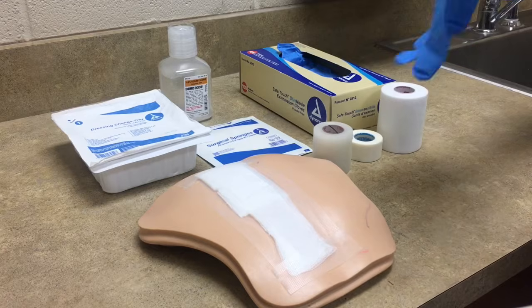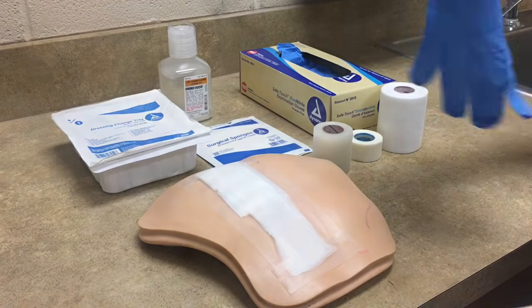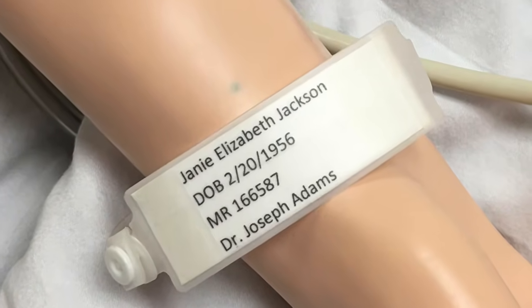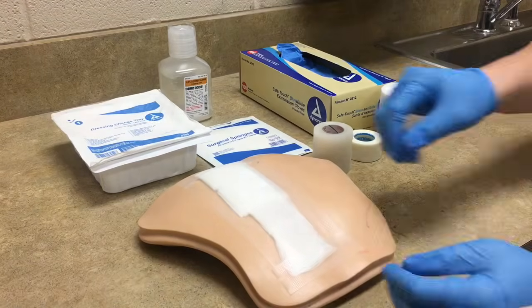We'll start our dressing by performing our hand hygiene and applying exam gloves, which will be non-sterile gloves. We would want to identify our patient using two patient identifiers, being the name and date of birth. We will carefully remove the soiled dressing.